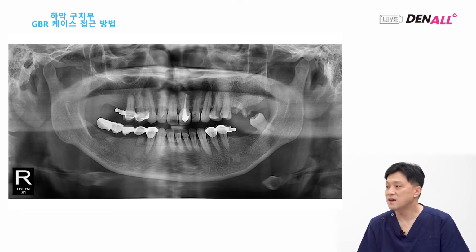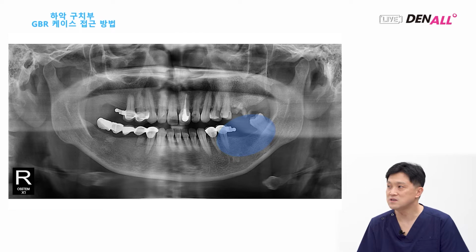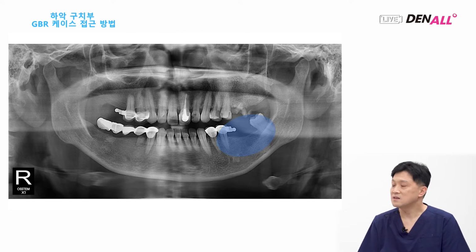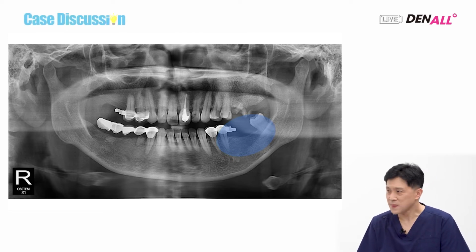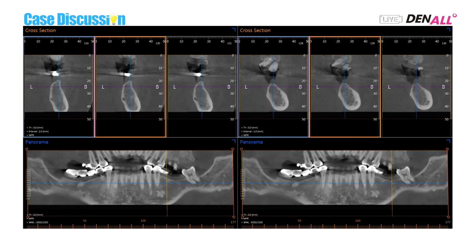So I brought my patient's case here. In quadrant 3, 1, 2, 3, 4, actually implants are needed. Let me show you how I treated quadrant 3. The horizontal width is very small, but the distance to the mandibular canal is long enough, so I used another option. On the CT at number 5, you can see knife edge bone width. Number 6 has some horizontal bone width.